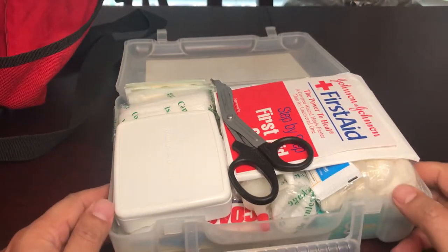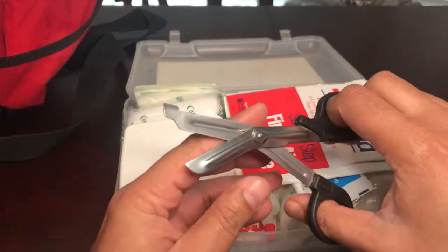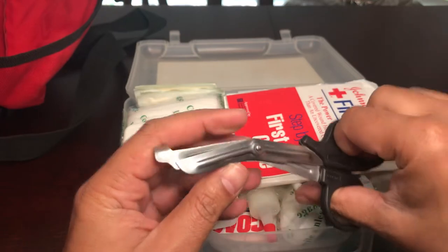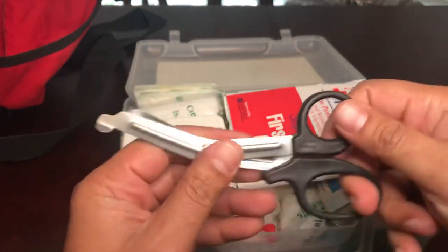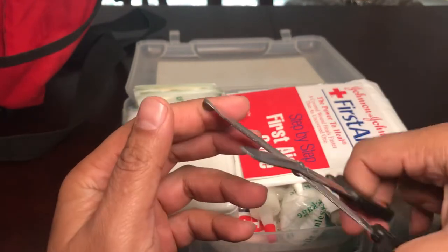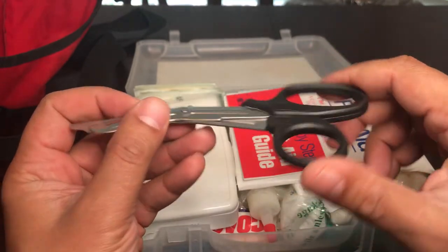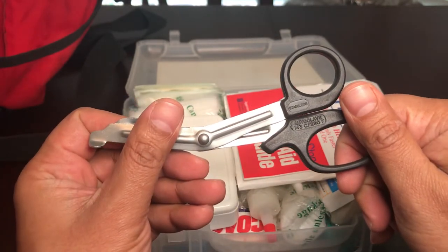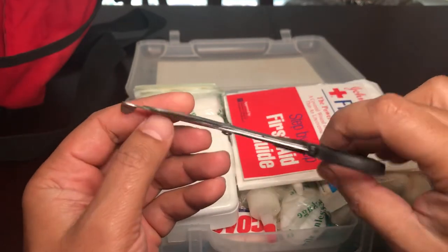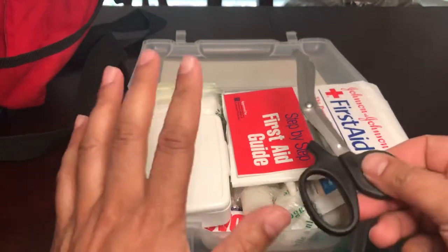Right on top I have medical grade scissors. These are for cutting off clothes, cutting bandages, or cutting gauze. They are not regular scissors — they have serrations and are really heavy-duty. I got these from an army surplus store, but you can buy them at a medical store or CVS.